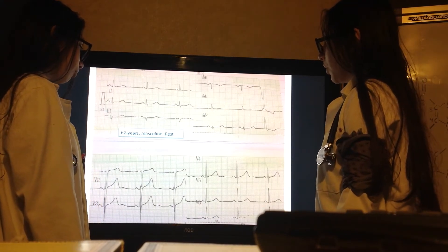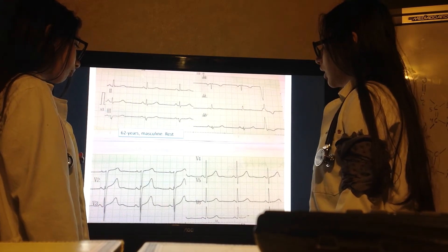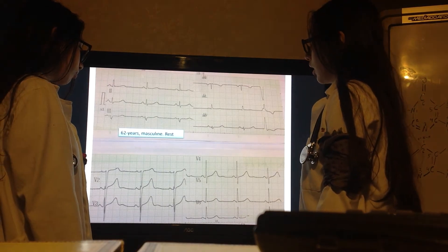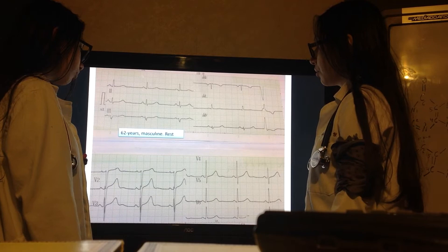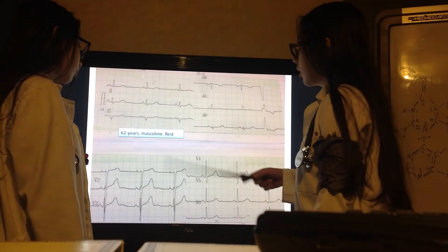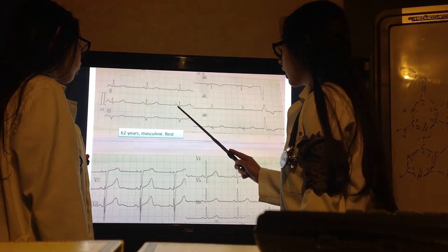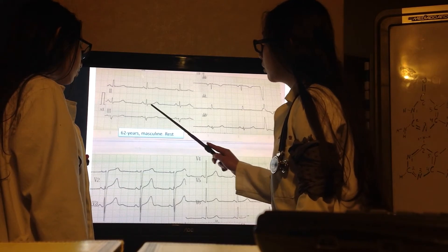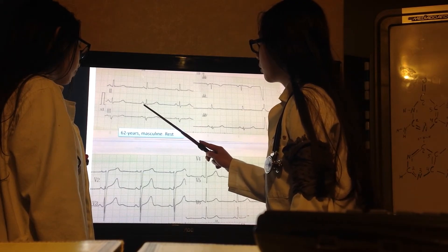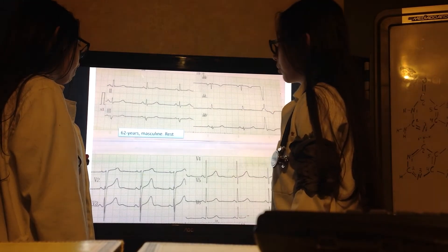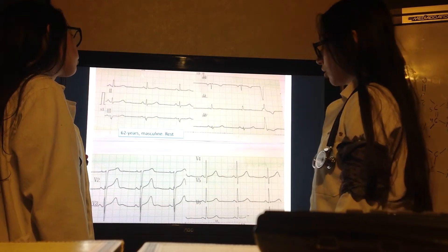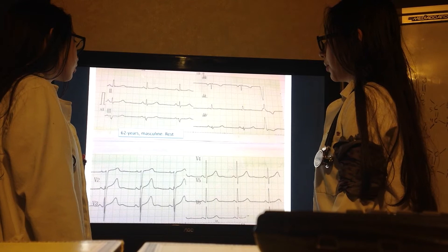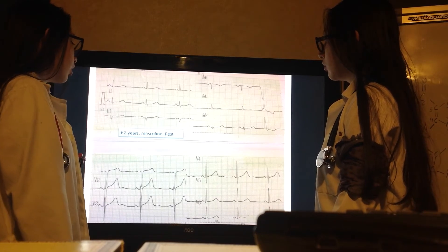Left atrial hypertrophy is assessed by the width of the P wave in D2, which has to be less than 0.12 seconds — that is, 3 small squares. Here it is like 2.5 squares, which is 0.1 seconds, and here maybe 2 squares, so about 0.08 seconds. It is less than 0.12 seconds, so there is no left atrial hypertrophy.